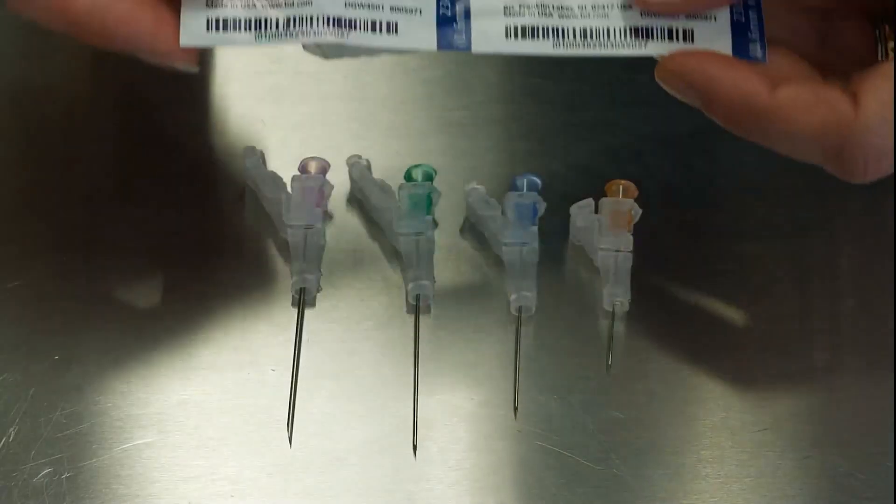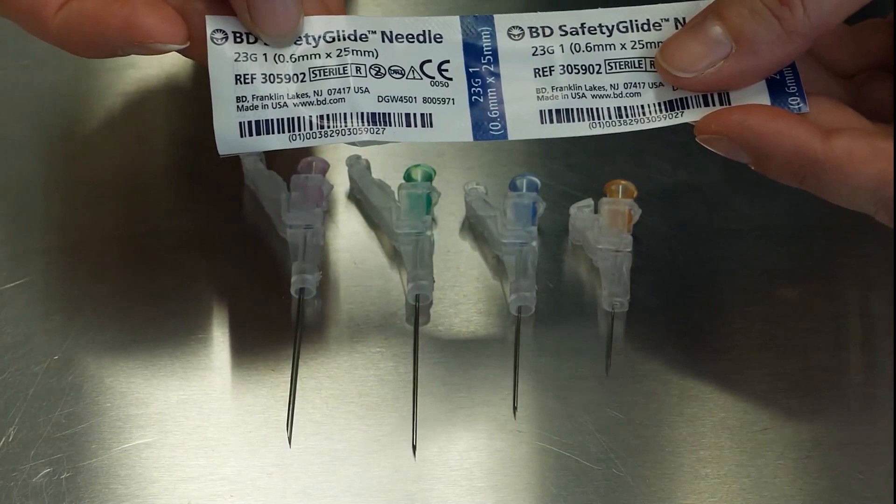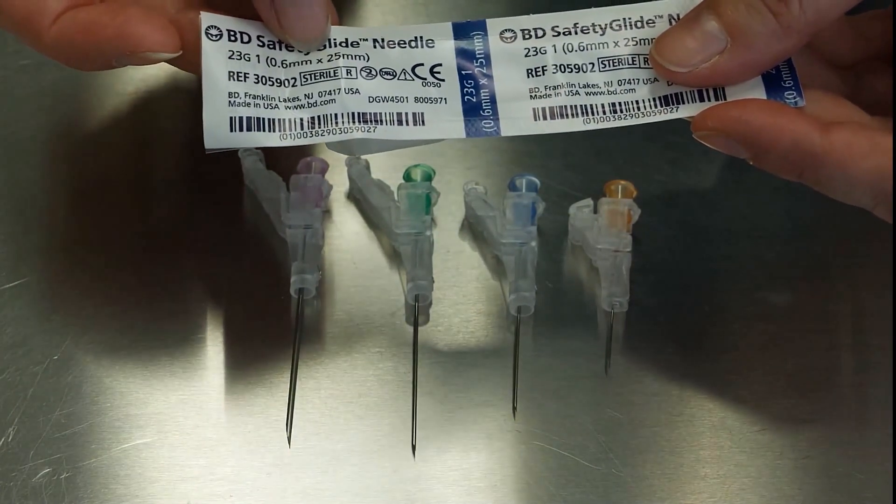Now we're going to go into needle sizes, and right after I'm going to get poked with an IM injection, which Kat will do on me. On the outside of every package it's going to show you the gauge and the length of your needle, so you don't have to guess and you don't have to compare.